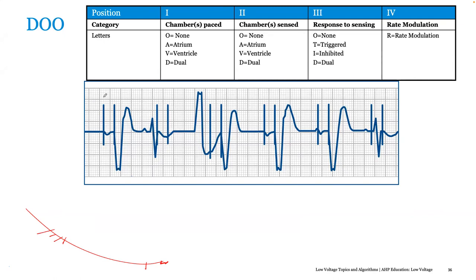The cardiologist saw the patient one day on a follow-up, and I asked him to do an EKG. So the EKG was forwarded to me. That was 2 days ago. Can you look at it and comment on what type of programming we should do for this patient? I also sent it to Julius.